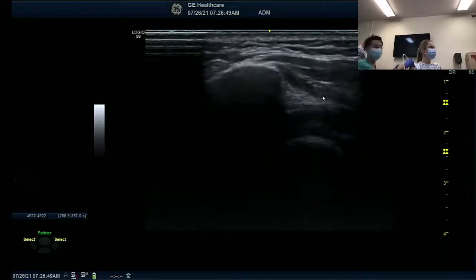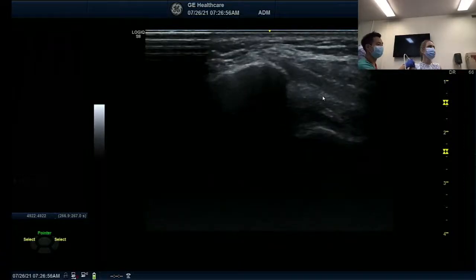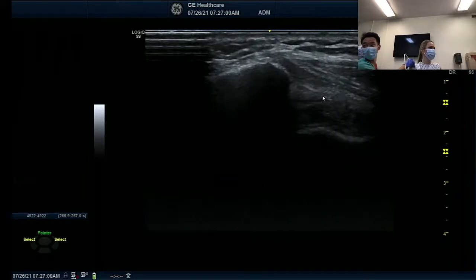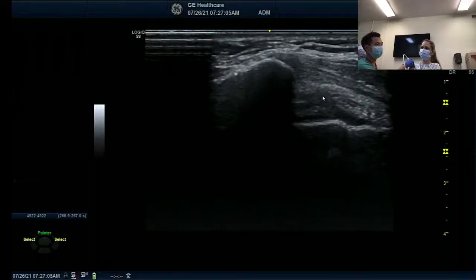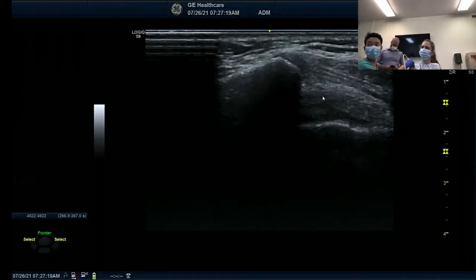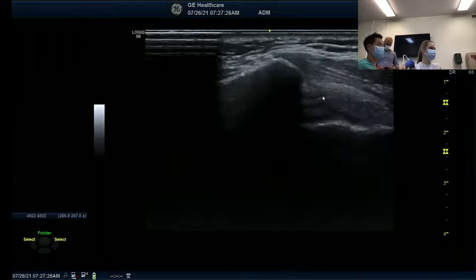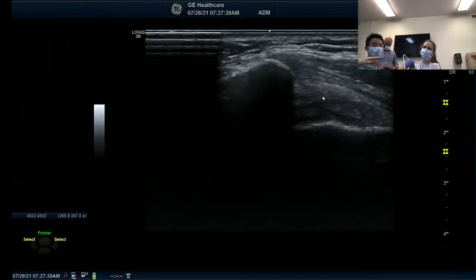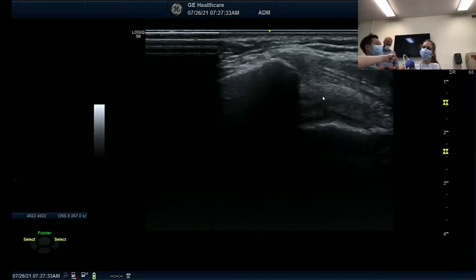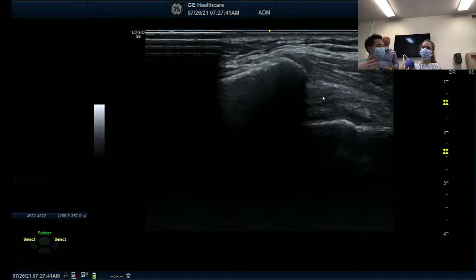We're just talking about the different approaches of the glenohumeral joint injections. This is the subacromial subdeltoid bursa, which is a separate bursa. It will only be together with the humeral joint if you have a tear in the muscle. Otherwise it's a separate bursa — it's not connected to the joint. If you have a supraspinatus tear, they become connected somehow. If you have a complete tear, you can basically inject anywhere — inject glenohumeral and it will get here, or inject here and it will get to the joint. But if the joint is normal and you only have the impingement, this bursa is separate.